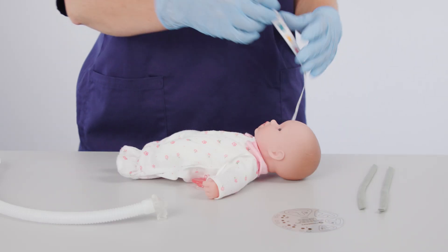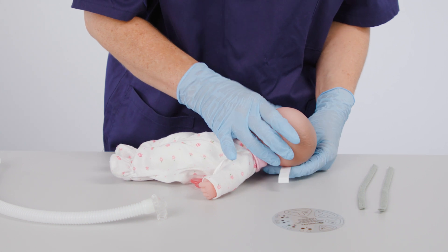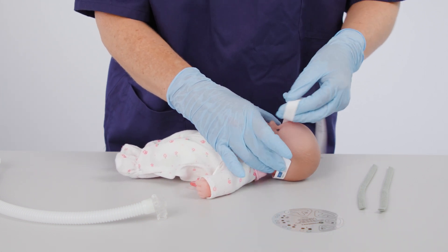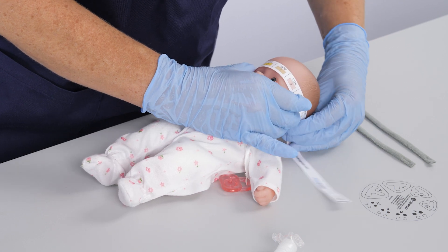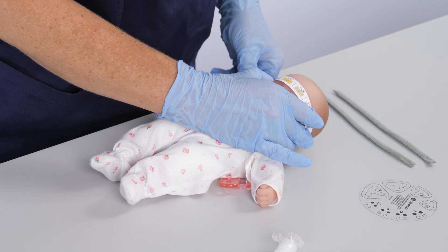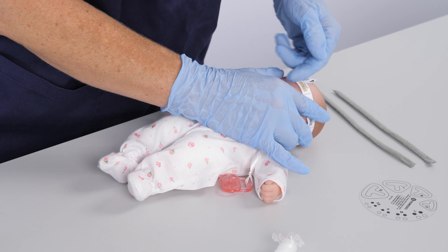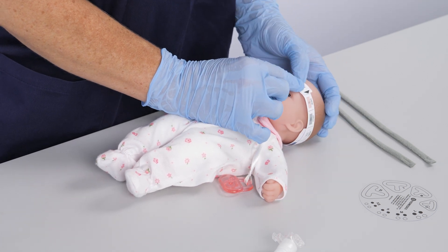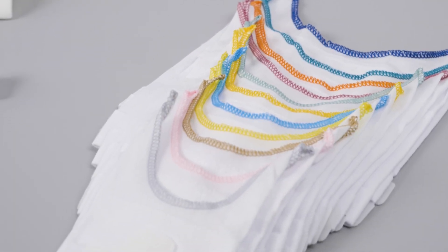Place the colour-coded tape around the infant's head using the forehead and nape of the neck as points of reference. The correct bonnet will be indicated on the tape by the coloured area, which will match the appropriate size bonnet. Select the correct bonnet.